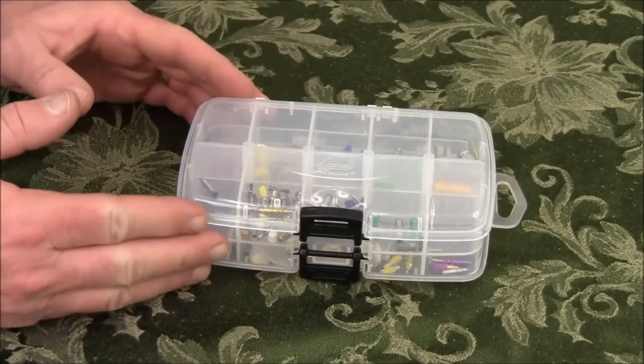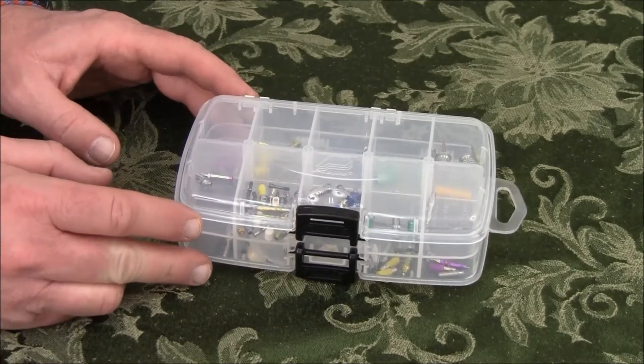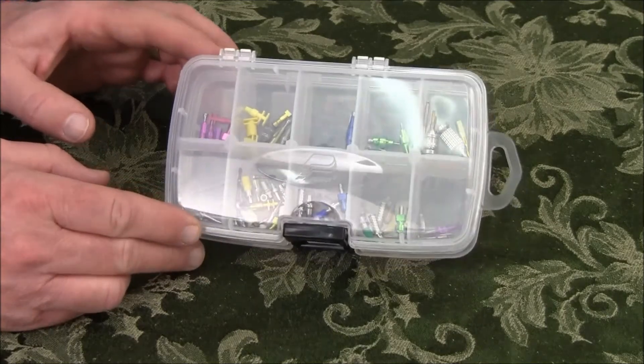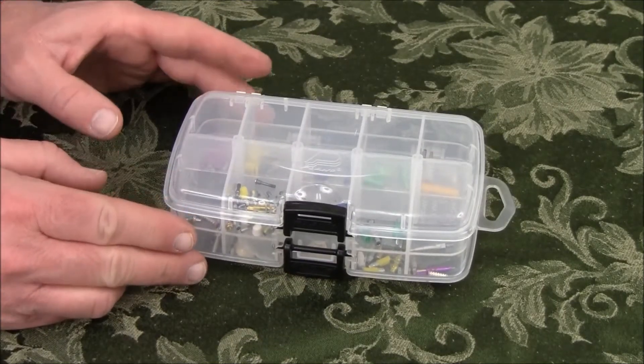It's simply a little organizer box — a fishing tackle box made by Plano. I found this at Farm and Fleet for under $5. It's got 20 compartments, 10 on each side, which I think is very handy because people a lot of times have multiple systems in their office.